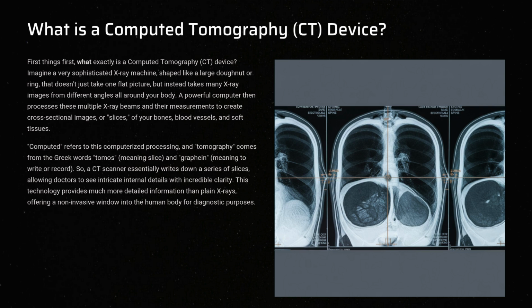Computed refers to this computerized processing, and tomography comes from the Greek words tomos, meaning slice, and graphein, meaning to write or record. So, a CT scanner essentially writes down a series of slices, allowing doctors to see intricate internal details with incredible clarity. This technology provides much more detailed information than plain X-rays, offering a non-invasive window into the human body for diagnostic purposes.